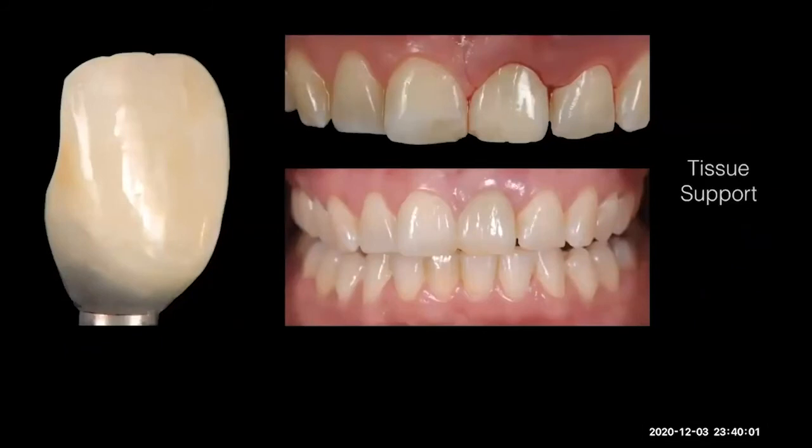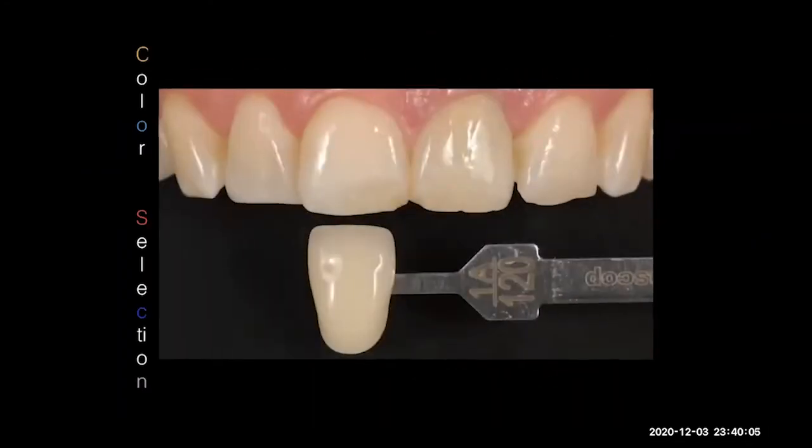Look, he took the picture before he removed the temporary. So this is the right moment to take the color. Not once you remove the temporary, because once you remove it, the patient has at least 5-10 minutes with his mouth open and the teeth get dry. So you need to do it in that moment.